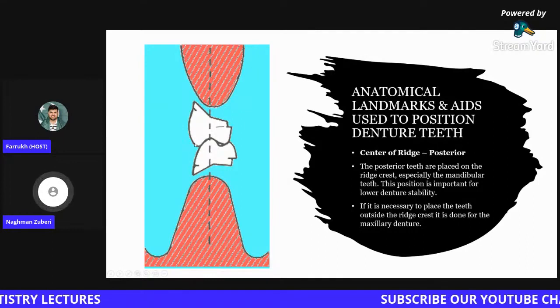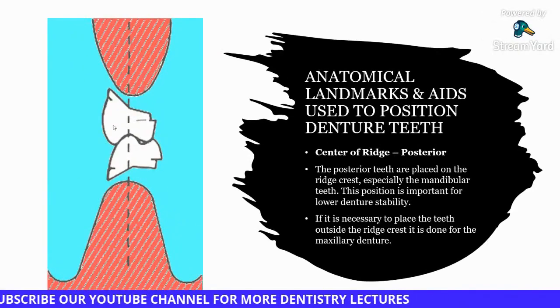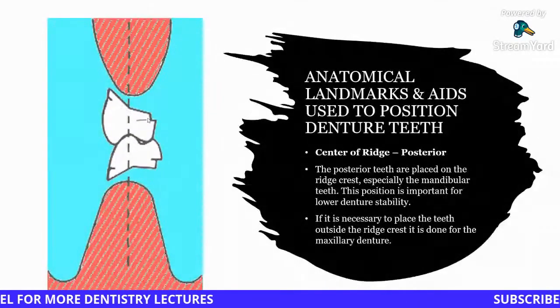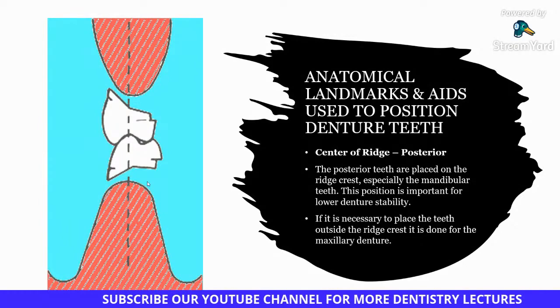If that horizontal overjet is not present, then chances are that the patient is going to have cheek bite. So in order to achieve that proper horizontal overjet, if we have to play with the positioning of the denture teeth, then we play with the upper denture teeth, not with the lower denture teeth.